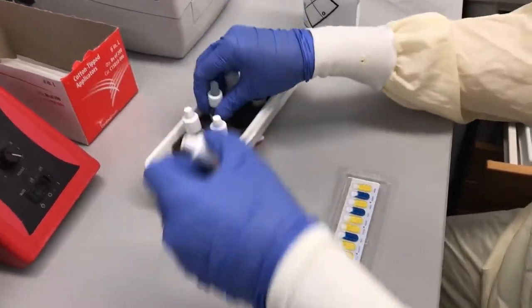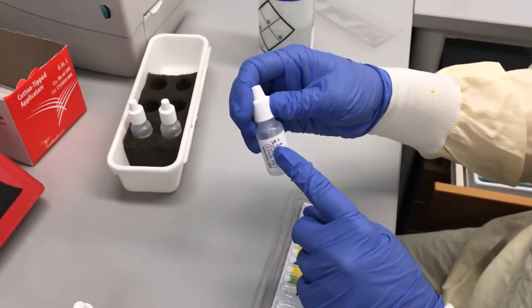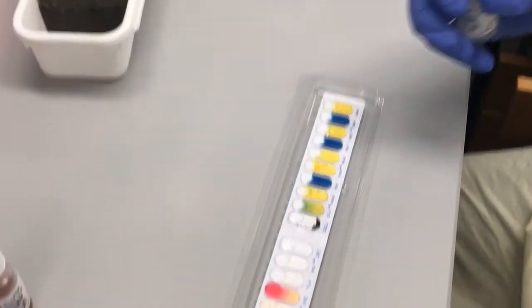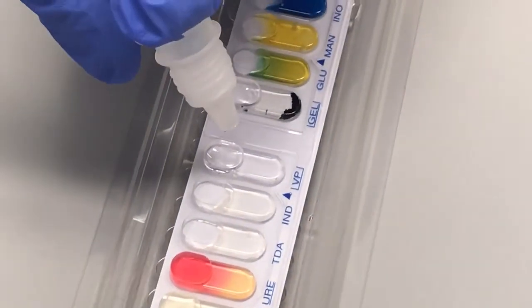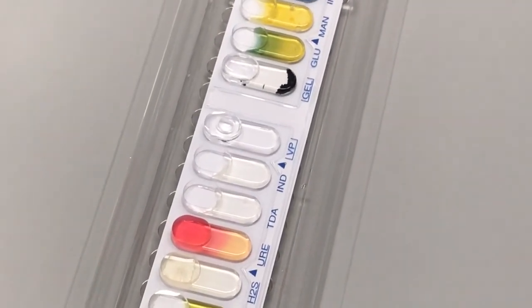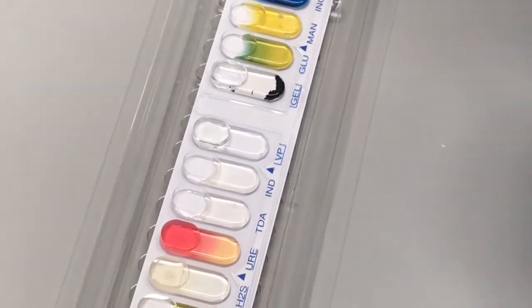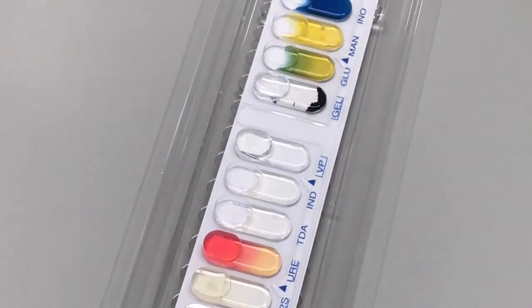Grab your reagents — VP1 and VP2 — and put one drop of each into the VP well. Make sure you don't put the dropper too close to the specimen because you don't want any splash back. If you get splash back on your reagent you have to throw the whole reagent bottle away because it is contaminated. If you happen to get a bubble in there, no worries — it'll go away. The VP well has to sit at room temperature for 10 minutes before you can read the color, so you want to do that one first.